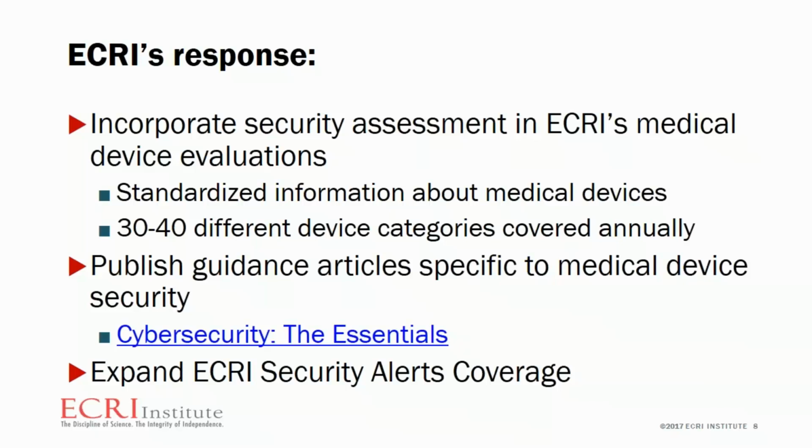medical devices. And that's really, rather than focusing on characterizing each medical device and how many thousands of vulnerabilities may exist in it, we thought the much more productive path is to identify what kind of an impact a device is going to have and what are the requirements of it when it is incorporated in your hospital's network. And that is now a standard requirement for all of our network-connected medical devices. We cover about 30 to 40 different evaluation categories annually that now incorporate this set of information.